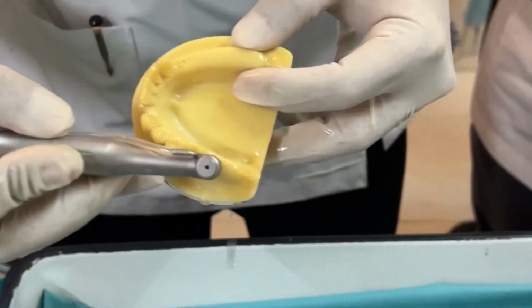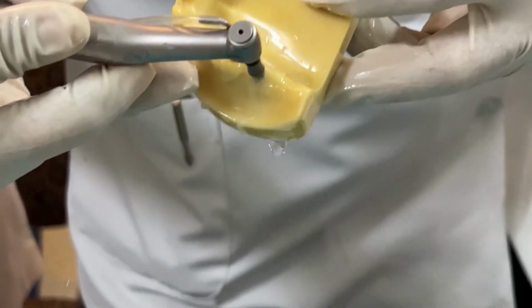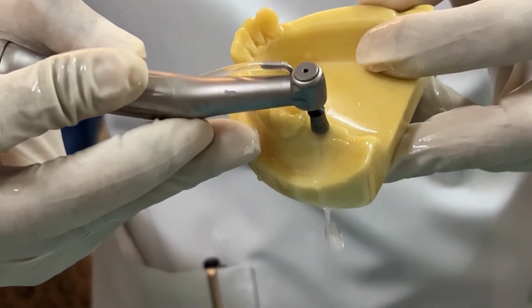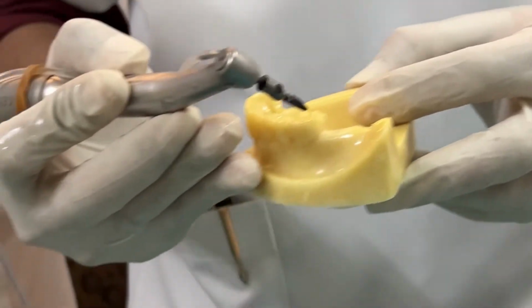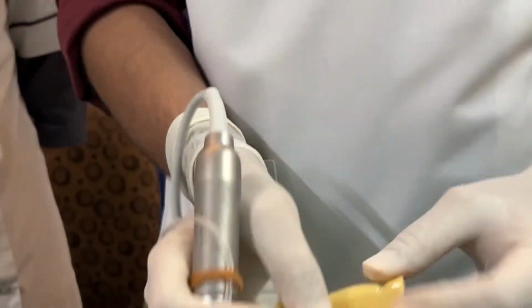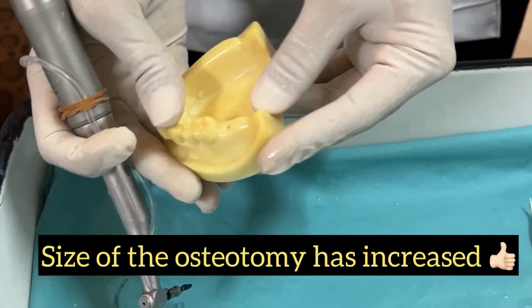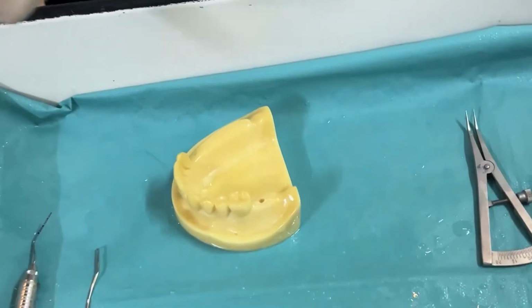Now again, this is 3.2, and straight away slight pumping motion also you can do, and you have taken it out. So 3.2 has been done. Now can you see the size of the osteotomy also increasing? Okay. The hole is comparatively wider. All of you are able to see.